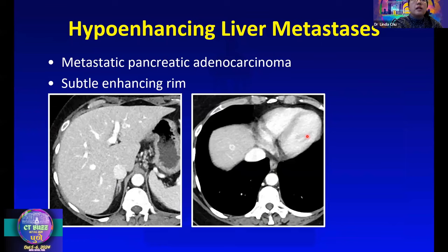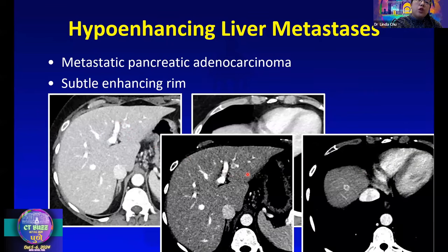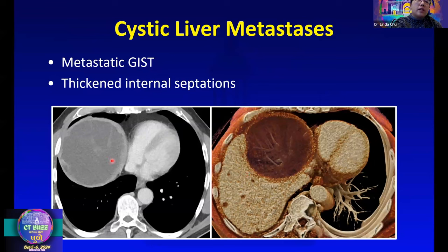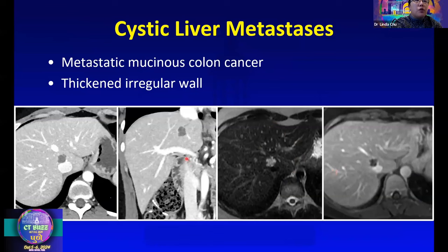Some classically hypoenhancing metastases may show a subtle enhancing rim on arterial phase images, and with these subtle lesions you may have to adjust the windowing of your liver to bring out the enhancement pattern. In cystic metastases, this case of GIST shows thickened internal septations that clue you in that it's not a simple cyst. Sometimes cystic metastases can be tricky — this case of metastatic mucinous colon cancer might look like a cyst at first glance, but it has internal septations and an irregular wall, better appreciated on the accompanying MRI.